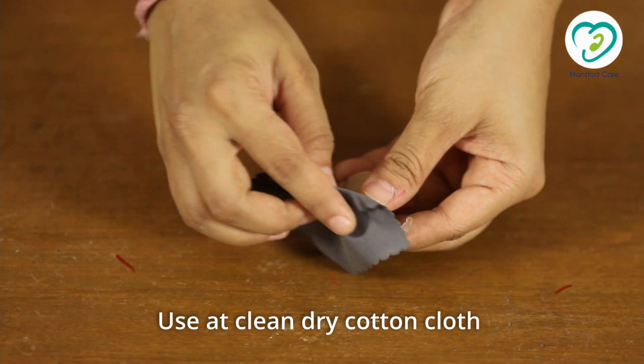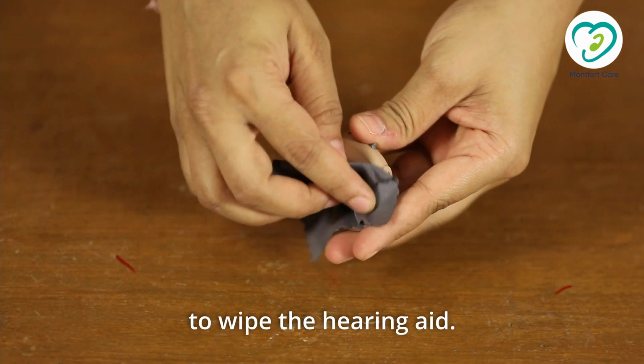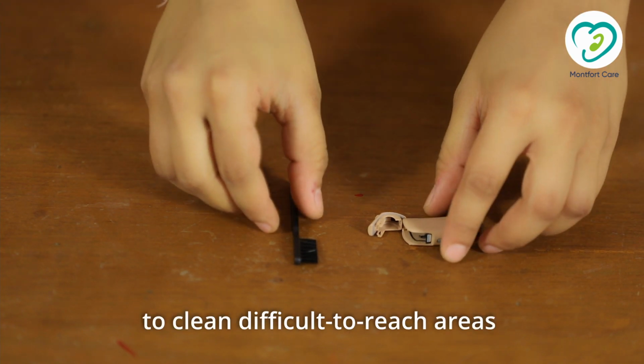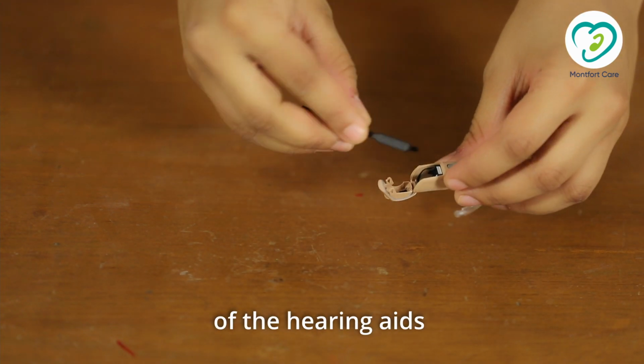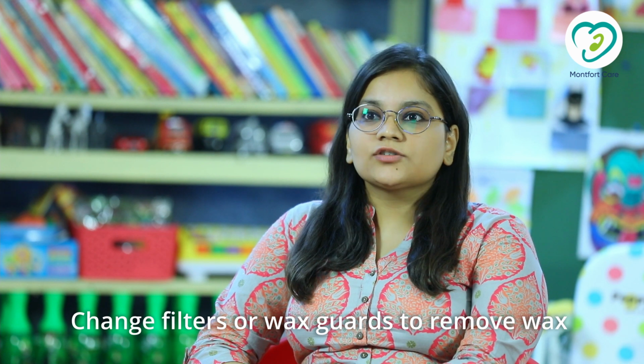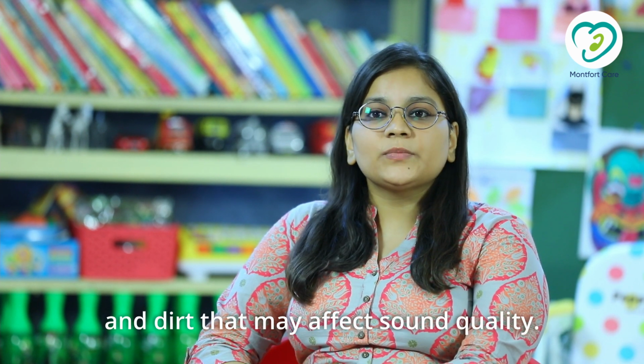Use a clean, dry cotton cloth to wipe the hearing aid. Use a soft brush to clean the difficult to reach areas of the hearing aids, like the battery compartment or other curves. Change filters or wax guards to remove wax and dirt that may affect the sound quality.